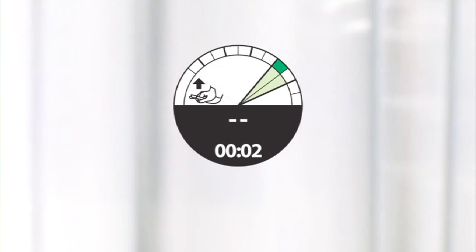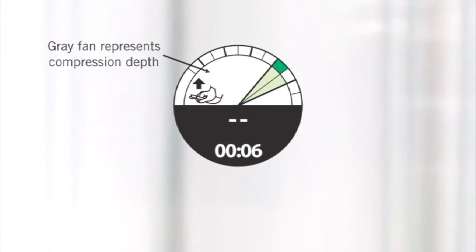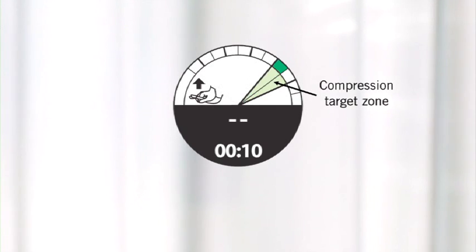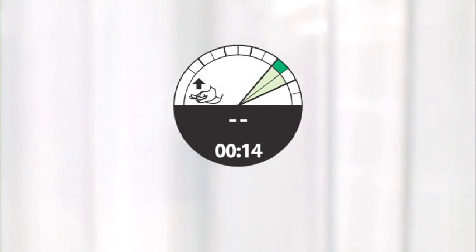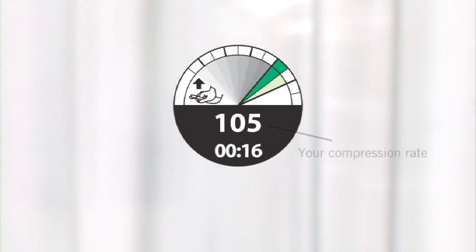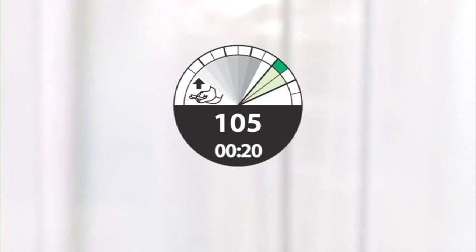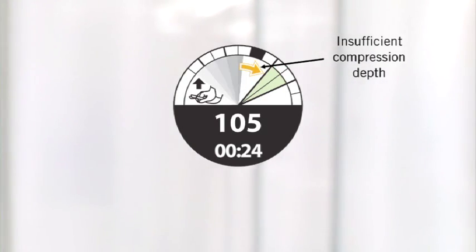Here's how the display guides you. This gray fan shows the depth of each compression. The compression target zone lights up each time you achieve sufficient compression depth. After several compressions, TrueCPR determines your compression rate and displays it. If you see this arrow, it means the last compression was too shallow and you should compress deeper.